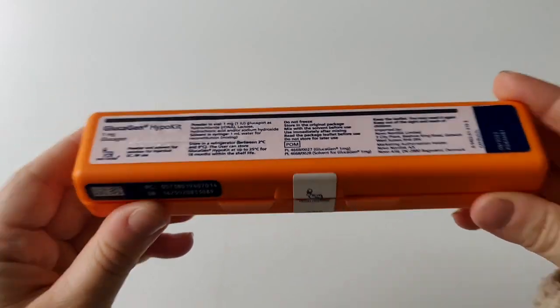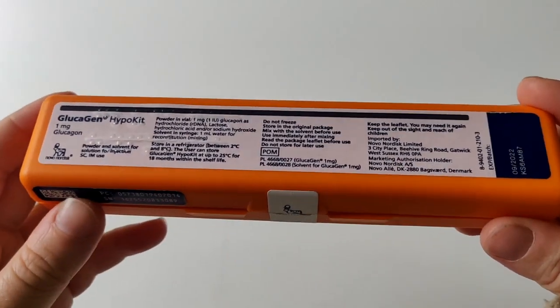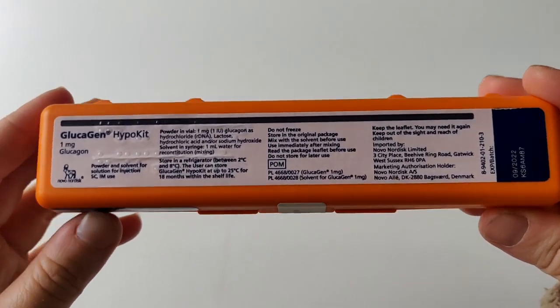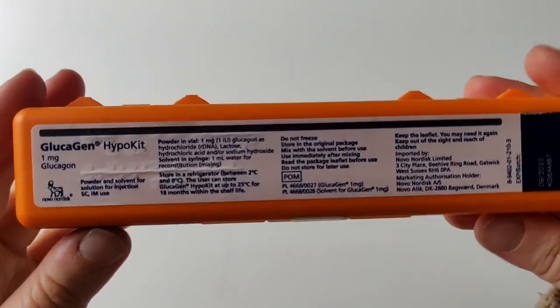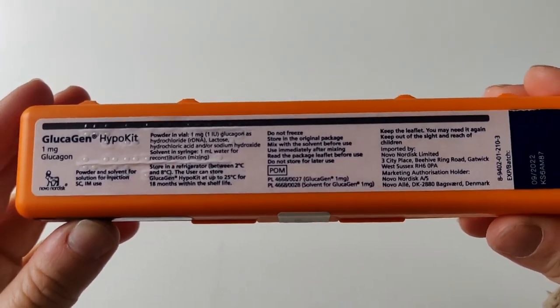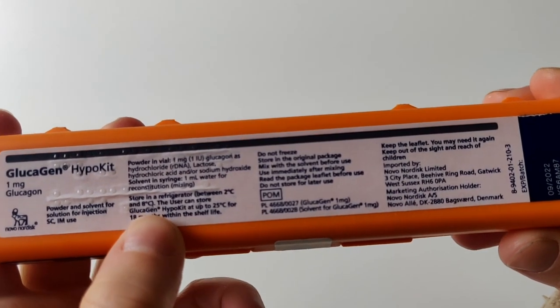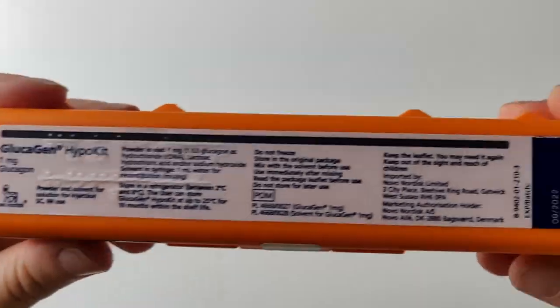One important note is that this has to be kept in the fridge at all times. I have one at home, and when I was in school there was one in the school as well. You could maybe put one in your workplace if you have someone there trained on how to use it. It says here: store in a refrigerator between two and eight degrees Celsius, and you can store for 18 months within the shelf life.